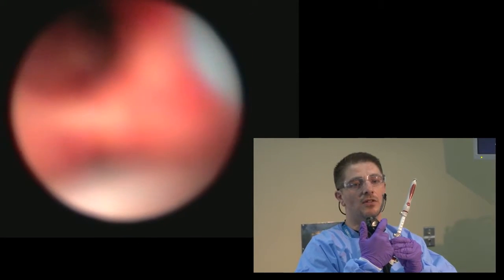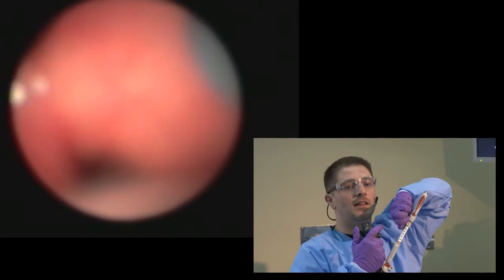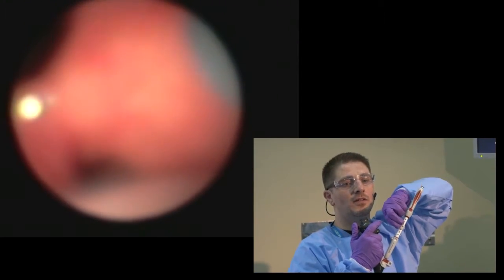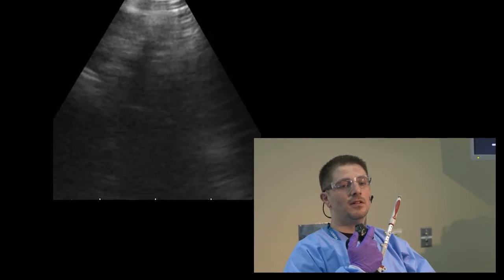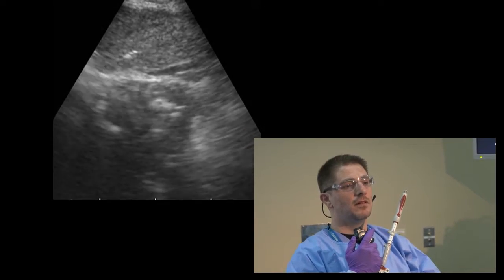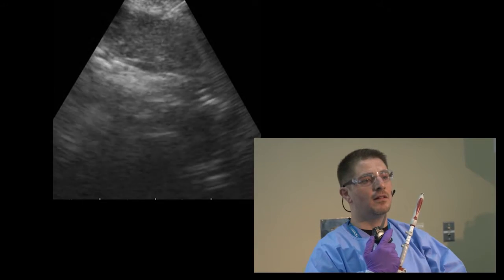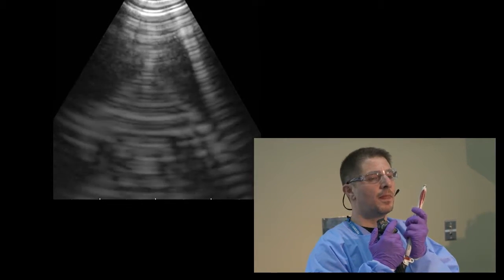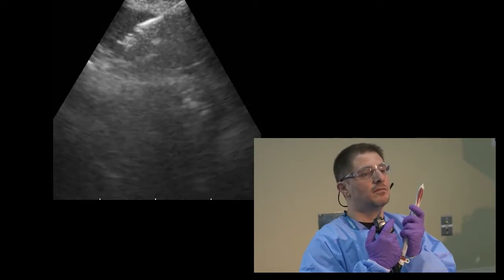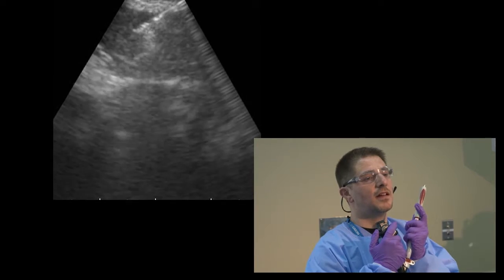You see the sheath on your endobronchial view. You set up the depth that you want to go with based on the size of the lymph node that you measured. Then you go down, you identify the lymph node again, and you pass your needle, and you can see it now inside the lymph node. You do the capillary action, keep the stylet in, and do the second pass.